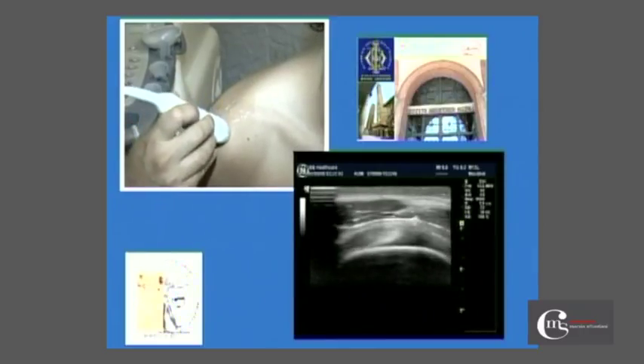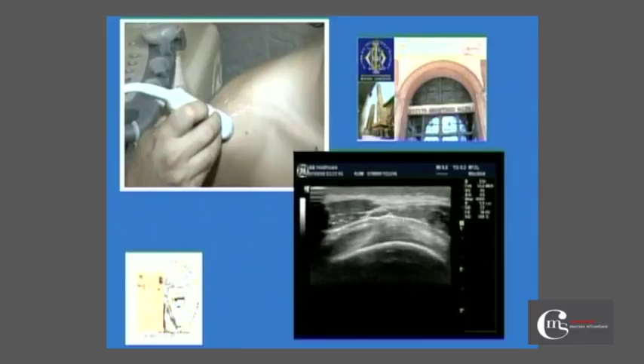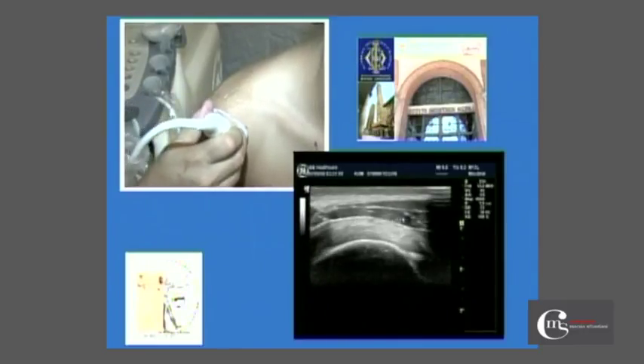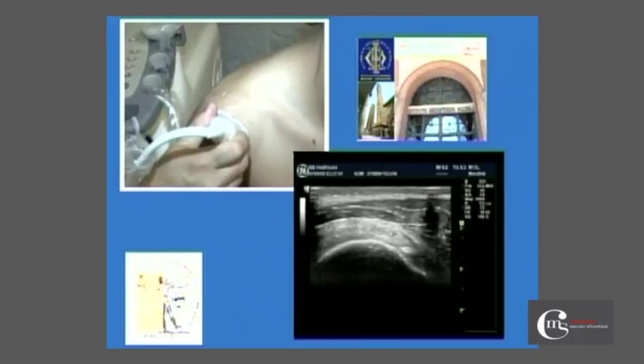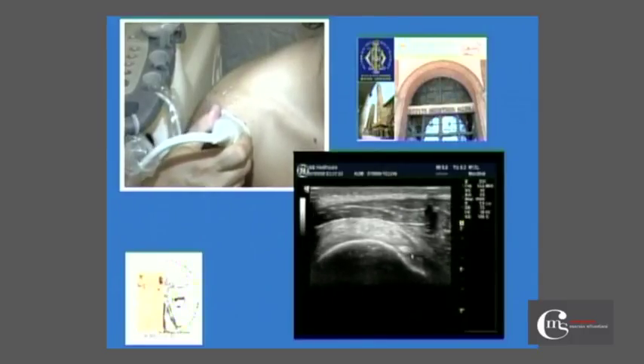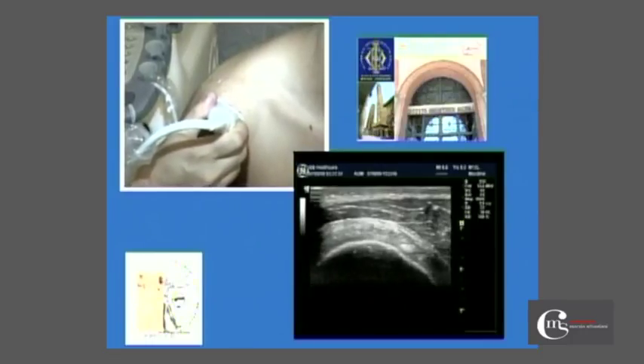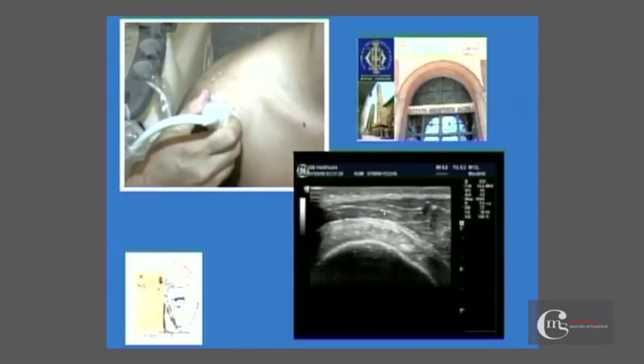We can see the insertion of the deltoid on the acromion. At this point, I rotate the probe and move in an anterior direction to the end of the supraspinatus tendon, where I meet the long head of the biceps in its intra-articular portion.